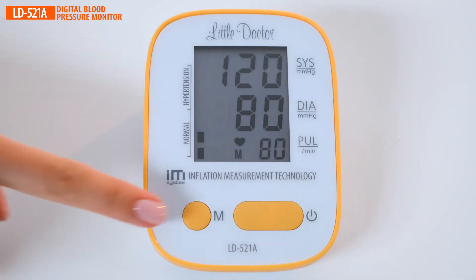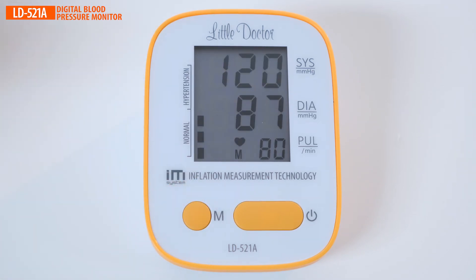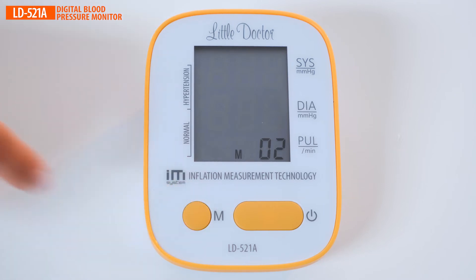The device memory stores the last 90 measurements. The average measurement feature gives better results for a series of measurements.